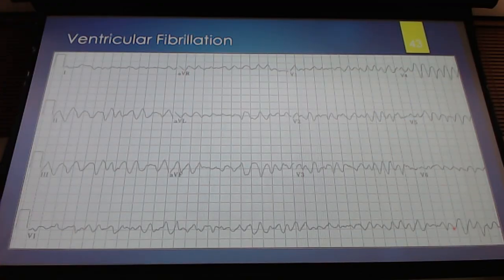There's not a lot of ECGs out there for VFib. So this is one that I did find. And again, there's nothing here that tells us this is regular. For those of you who've done ECGs before, it looks like there's a lead or a couple of leads that are off of this patient. But we check the leads, the patient's unconscious, this is VFib. There's nothing that we can really make any sense of, but it looks like something really bad is happening to this patient.